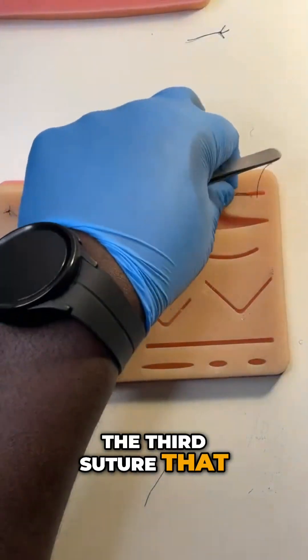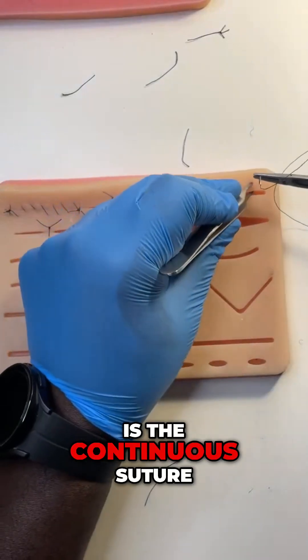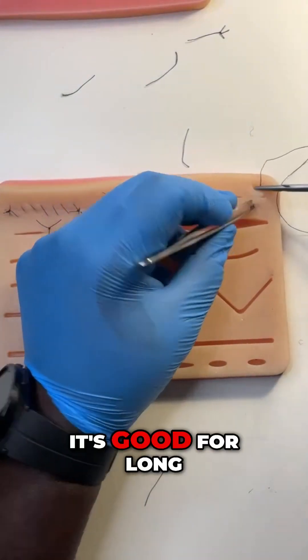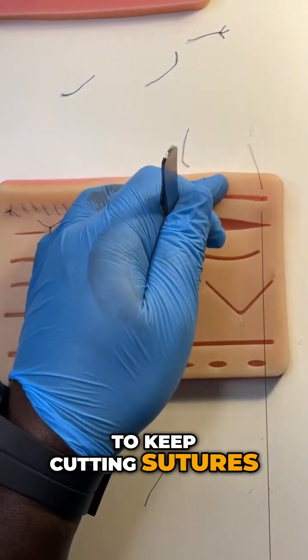The third suture that I have really enjoyed doing this week is the continuous suture. It's fast, it's good for long linear wounds, and saves me having to keep cutting sutures.